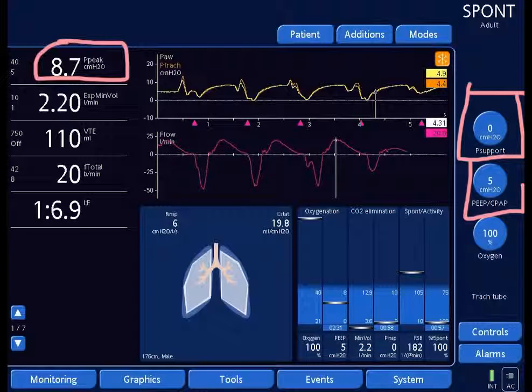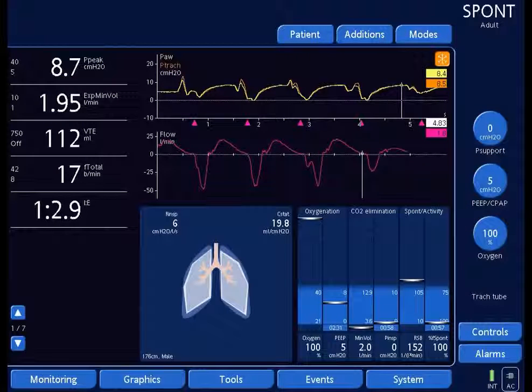We can look at the screen to see how reactive these servo control targeting schemes are. With every breath, there might be a different flow rate, and we might compensate at different pressure levels. If you notice this first one right here, my pressure is approximately 12 centimeters of water. It's a little higher. However, with these breaths, they're smaller and there's less compensation. As previously stated, automatic tube compensation can compensate for the added resistance during both the inspiratory and expiratory phases.